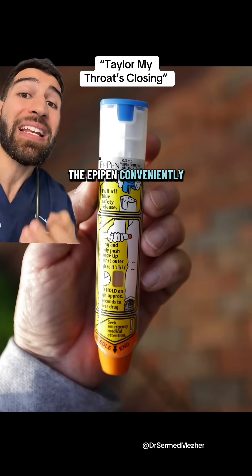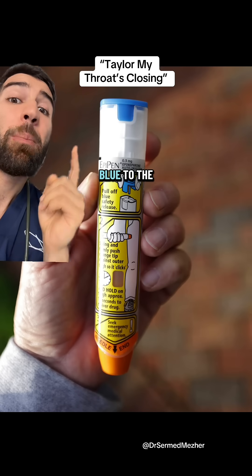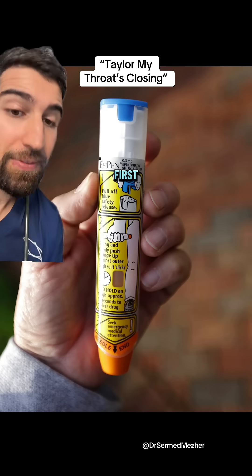Well, the EpiPen conveniently has two different colored sides and the needle is on the orange side, so you need to remember: orange to the thigh, blue to the sky. But that cap needs to come off before the needle will actually be dispensed, so you need to do that first.